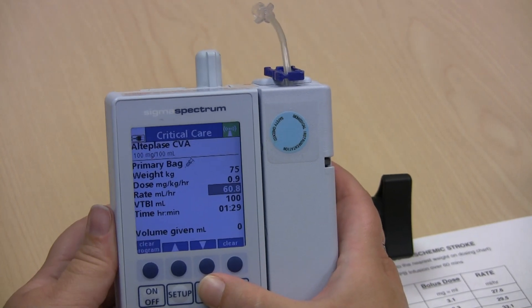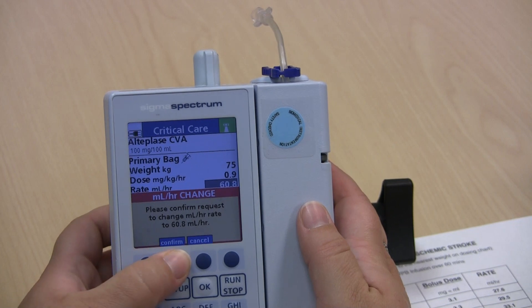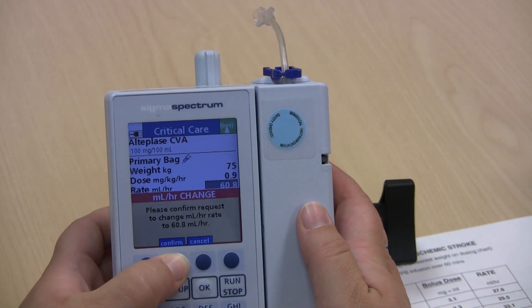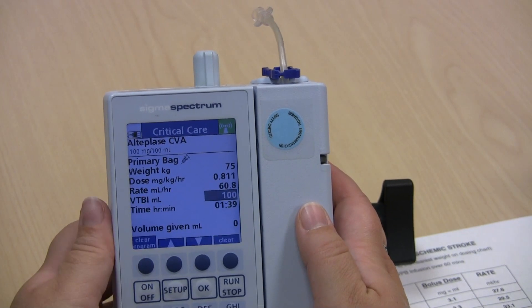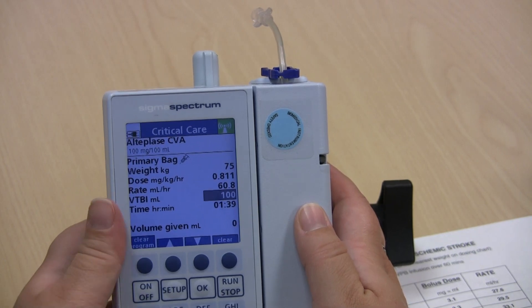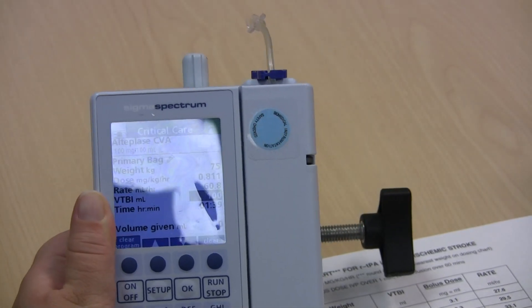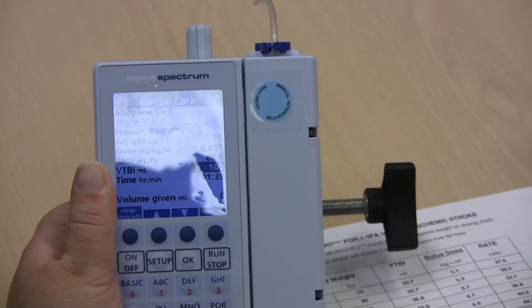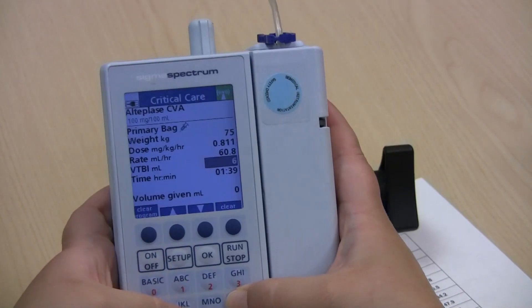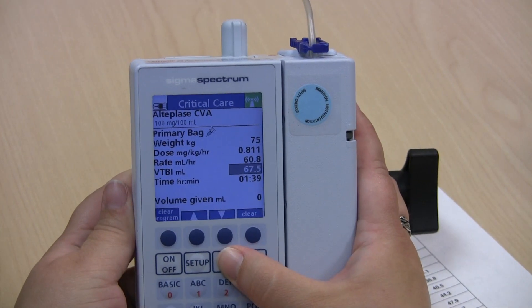Then press OK. Now press confirm on the mL per hour change screen. Now change the volume to be infused to the value from the table. For a 75 kilogram patient, the volume to be infused is 67.5 mL. Press OK when you're done with that.